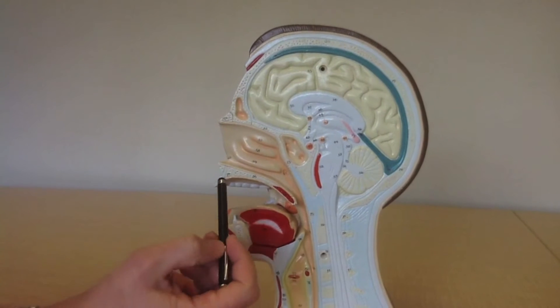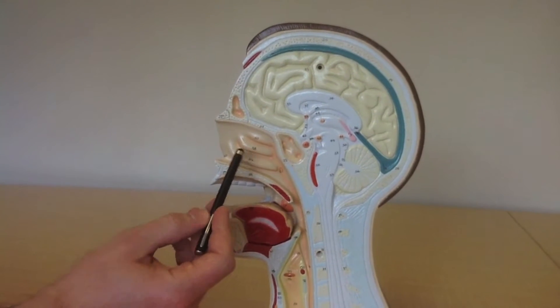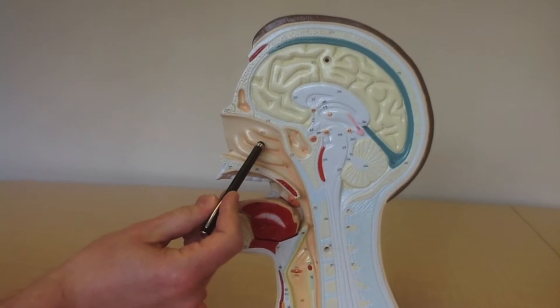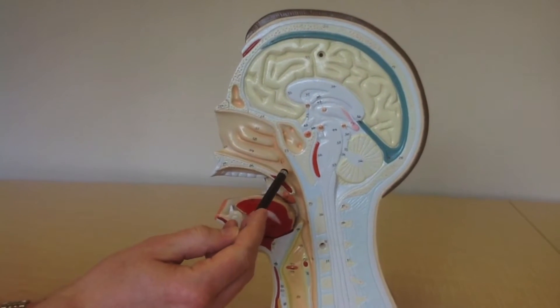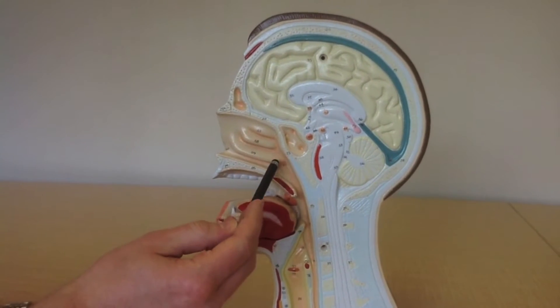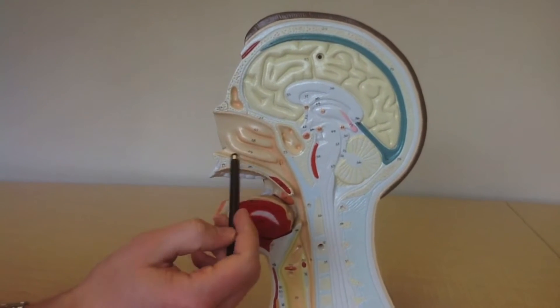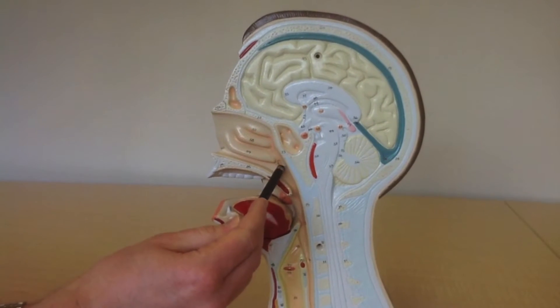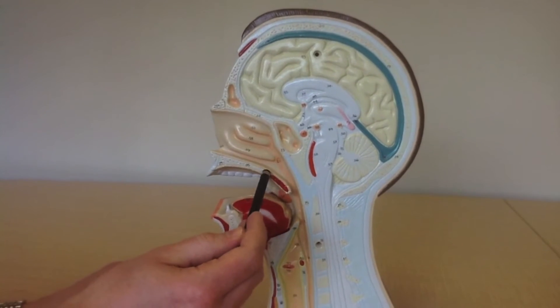In the nasal cavity, this structure here is the inferior turbinate. This structure is the middle turbinate. Posteriorly, in the nasopharynx, where the Foley catheter balloon will be situated, we can see the eustachian tube orifice here. This is the floor of the nose, and here is the soft palate.